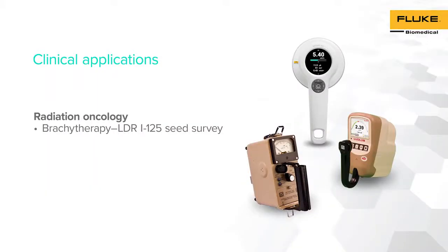The second demonstration consists of performing an LDR Iodine-125 seed survey as part of a source inventory. The results are compared between an ion chamber and the RACE-A 452 survey meter in exposure mode.